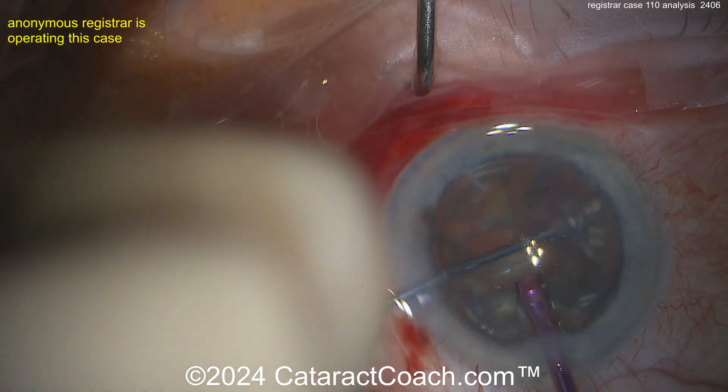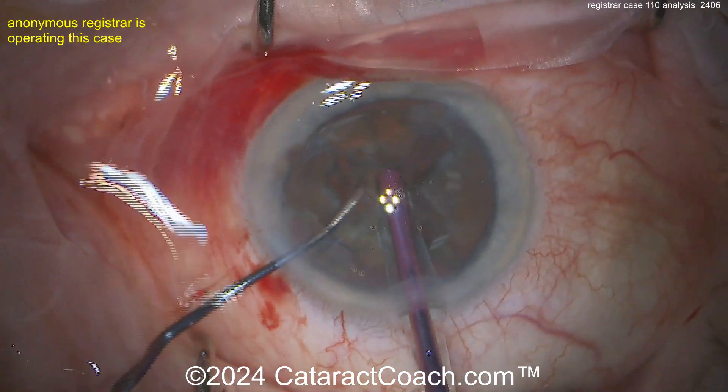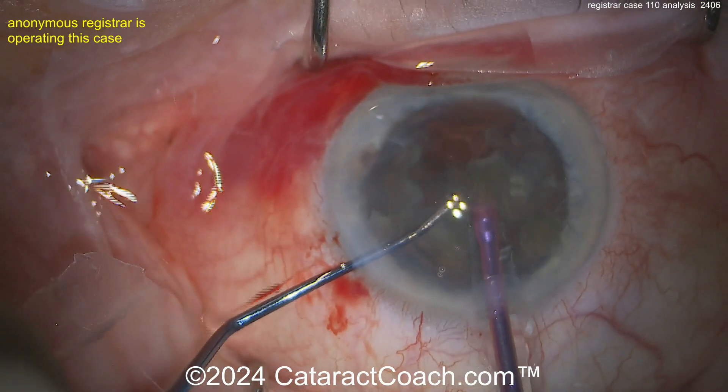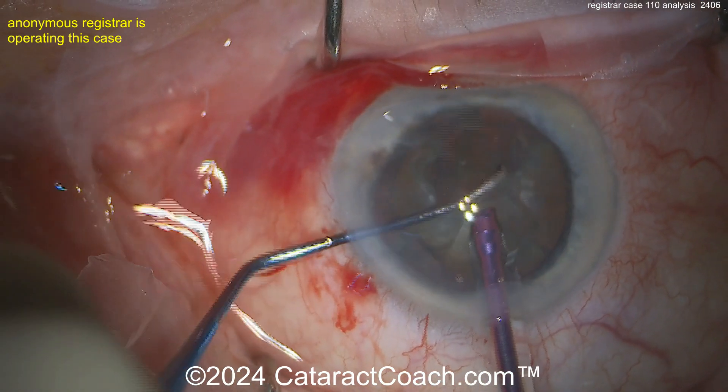Nice and easy, beautifully done. Didn't quite get the chop — that's okay. Sometimes you can take out a couple of the quadrants first; it gives you a lot more room and makes it easier to maneuver around the pieces. Some surgeons like to chop everything in the bag first, then remove the pieces.